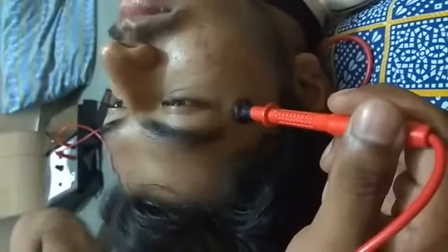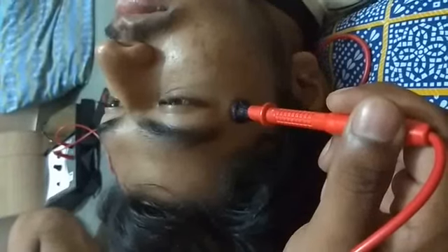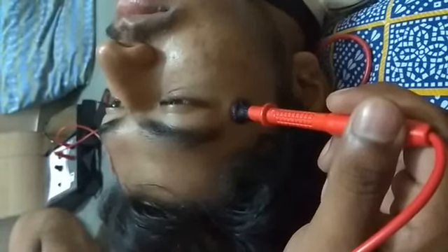For the facial muscles, the reference electrode we can put at the C7 cervical spine. This is the motor point for the frontalis muscle. This is the motor point for the corrugator muscle. This is the motor point for the orbicularis oculi muscle.